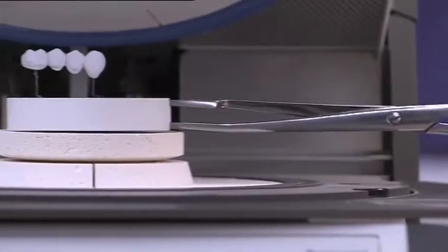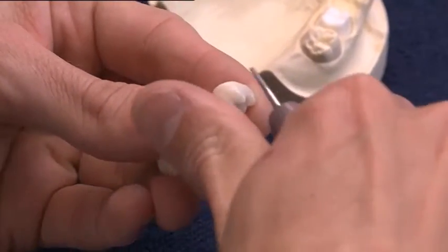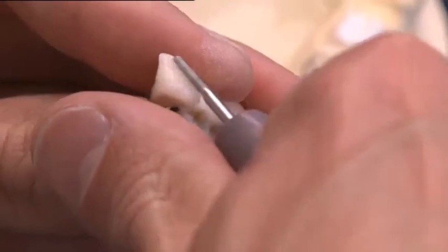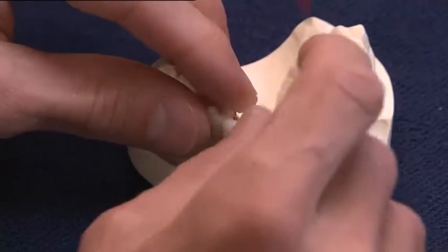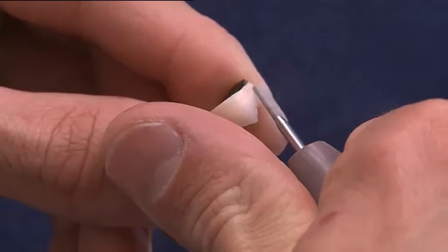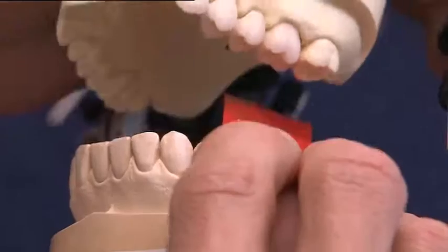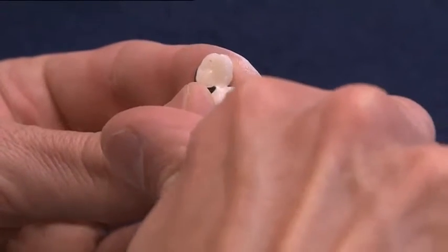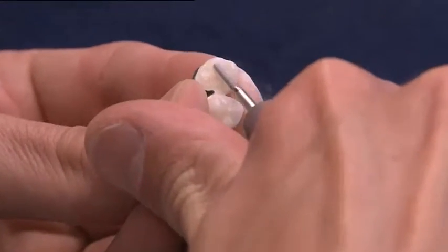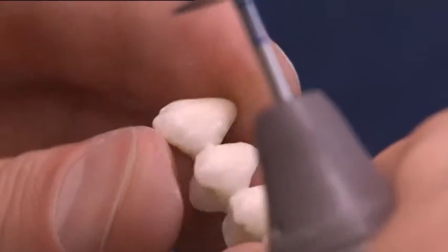Subsequently, the first dentin incisal firing is conducted according to the respective firing parameters. The ceramic bridge is finished with the recommended grinding instruments. The occlusal contacts and proximal contact areas are checked on the model and in the Stratos and adjusted by grinding. Subsequently, a thin diamond disc is used to separate the interdental areas down to the opaquer.